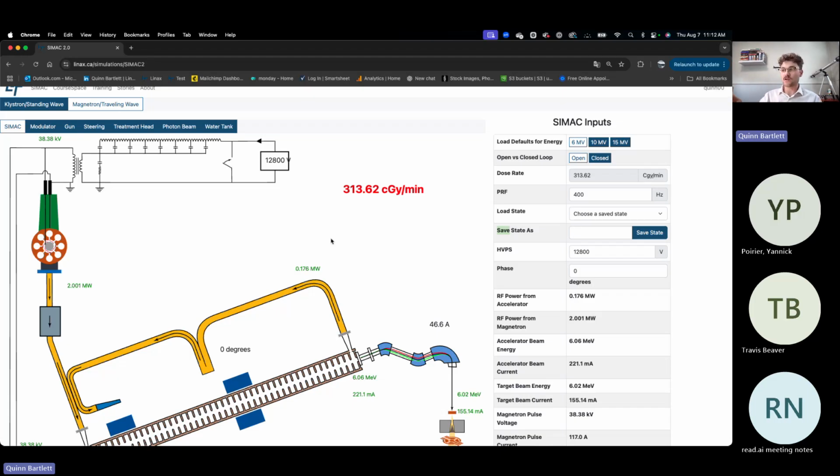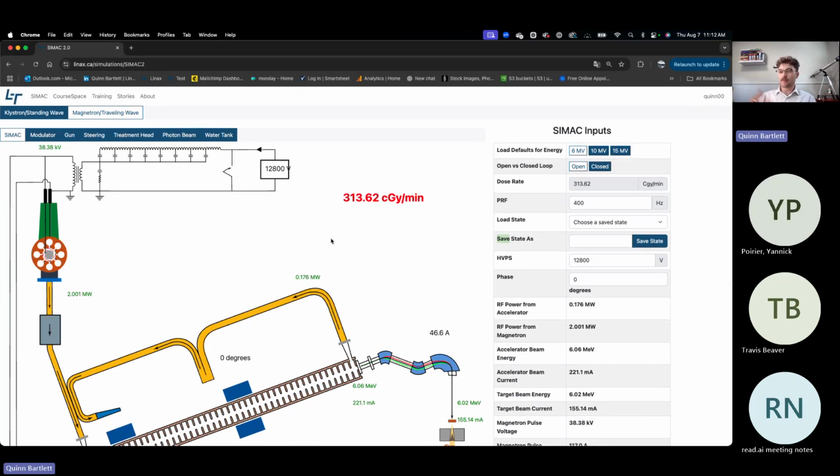the Linac. Obviously it's not going to replace or supplement the results you're going to get from the Linac, but it can reduce the time needed for setup, and then reduce the number of scans or runs, the beam-ons, that you actually need to do on your machine. We've seen a little bit of success with that with some of our customers, but we'd hope that more people can utilize those types of features.